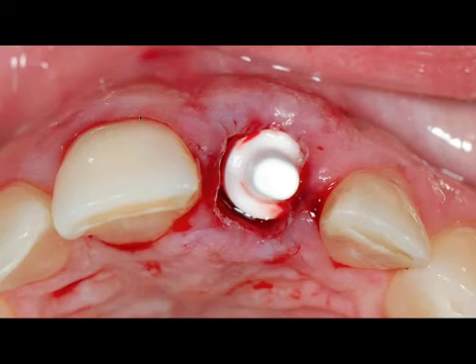We have ample tissue to the facial. We have a little bit of a void around the implant. That was the difference between the size of the tooth and the implant that's going in, much smaller than what we would have seen with a small titanium implant. And we can see how the implant in the socket is essentially, when we're looking down on it, crown prep.